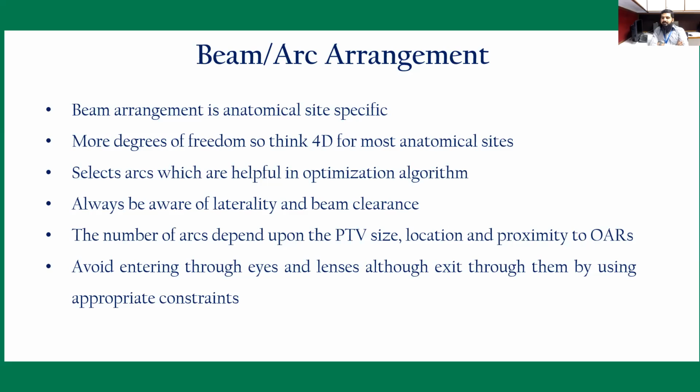How many arcs we can introduce depends on the PTV size, the location, and the OARs, and how much priority we are defining. Remember that if you are planning for head and neck tumors, avoid entering through the eyes or lenses, although exit may be allowed with the appropriate constraints.